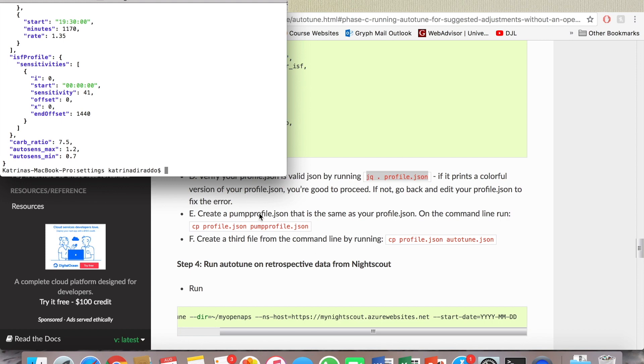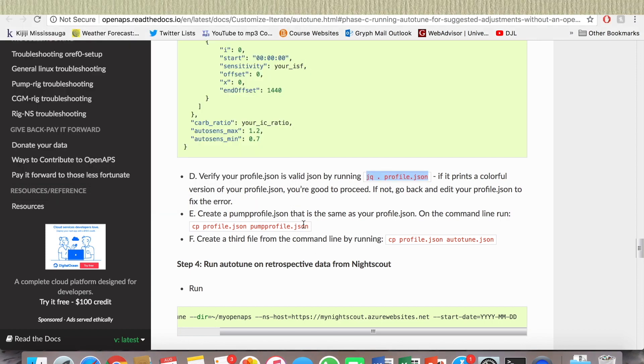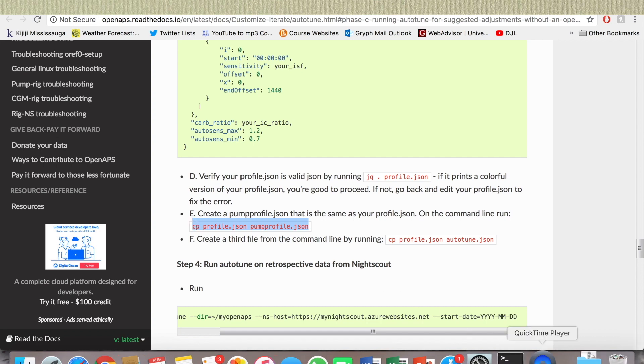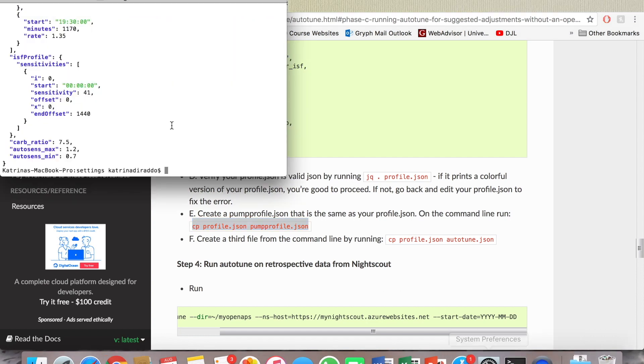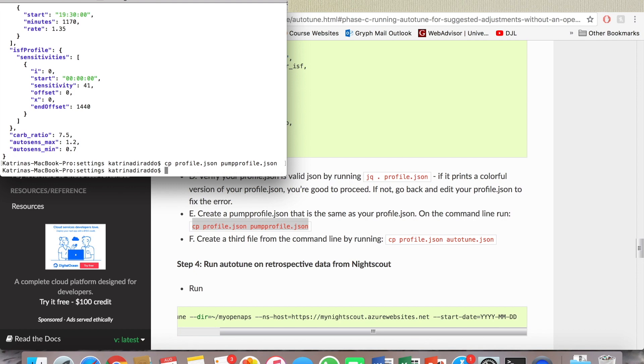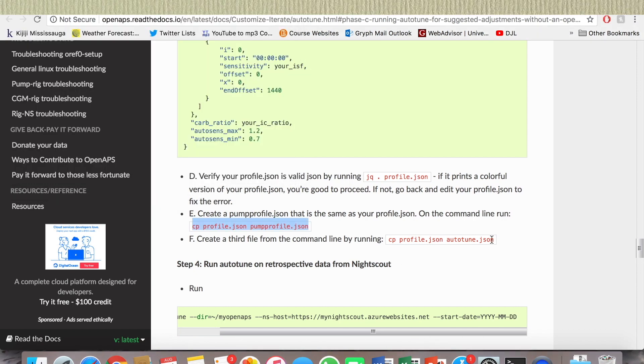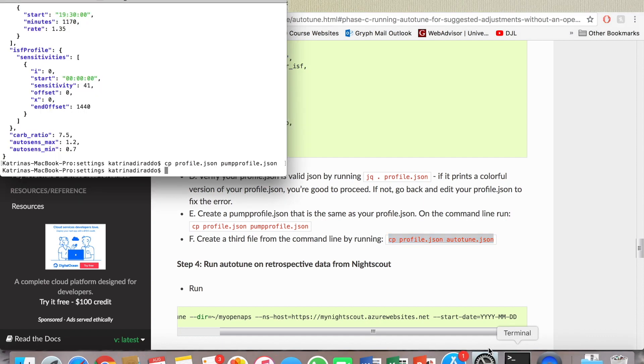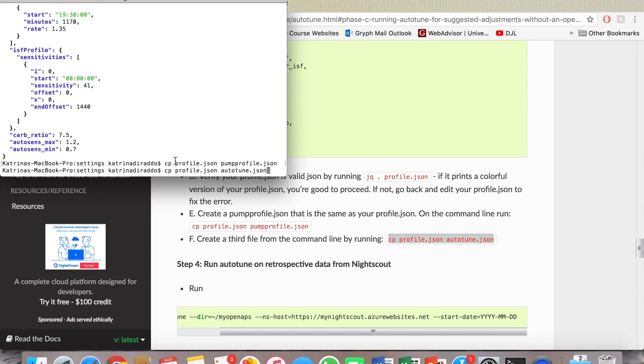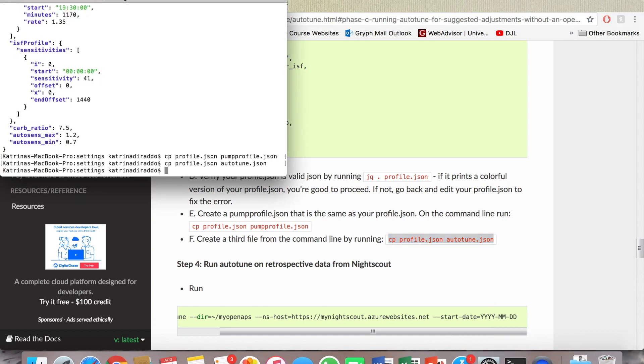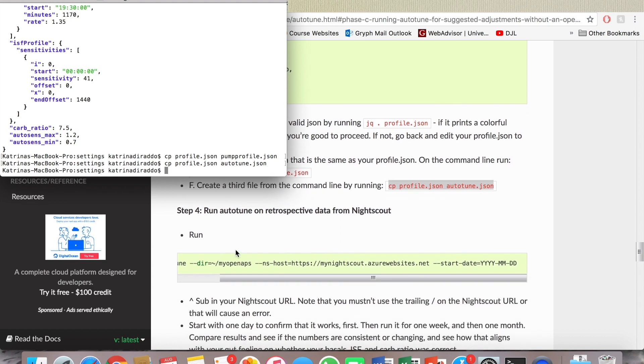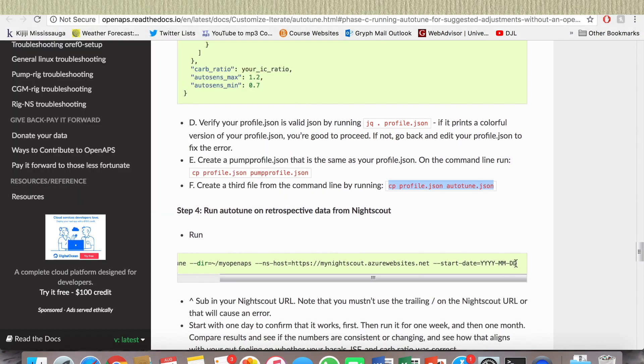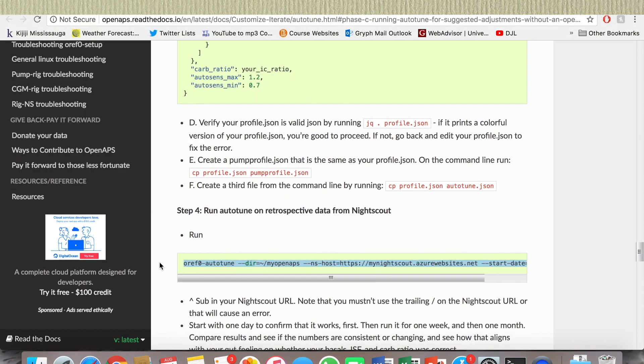So now create pump profile. I'm just gonna copy this. I'm assuming I don't have to add anything to it. Copy, paste, enter. Nothing comes up but I don't think anything is supposed to. I'm gonna do the same. Copy, paste, enter.